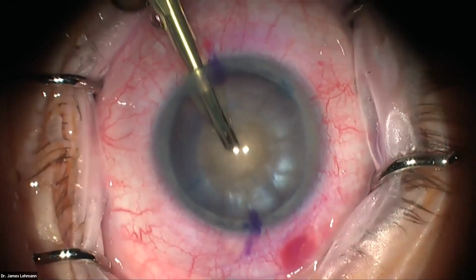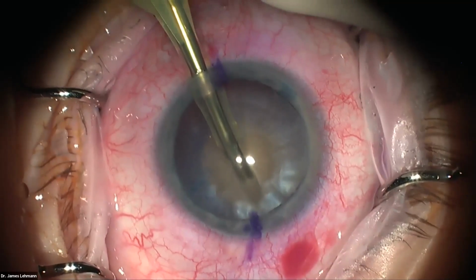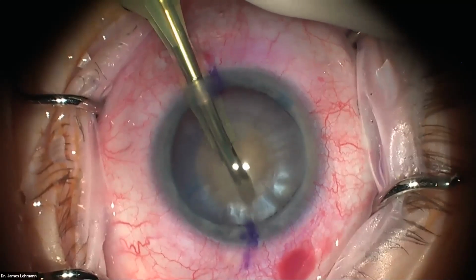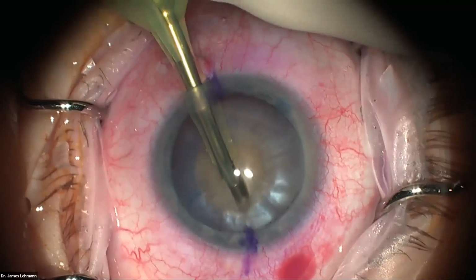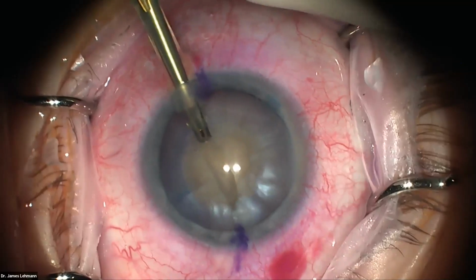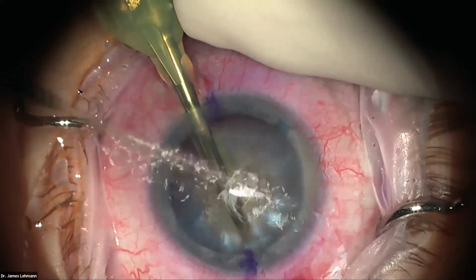And I can't really see where the Femto did its work. But I'm just going to start with the groove right centrally. And I'm using only a moderate amount of pressure. It doesn't seem too deep yet. You can see the lens moves. That tells you there's not much cortex. But it doesn't move too much. It's not scary moving like that, as it would be if it didn't have good zonules.